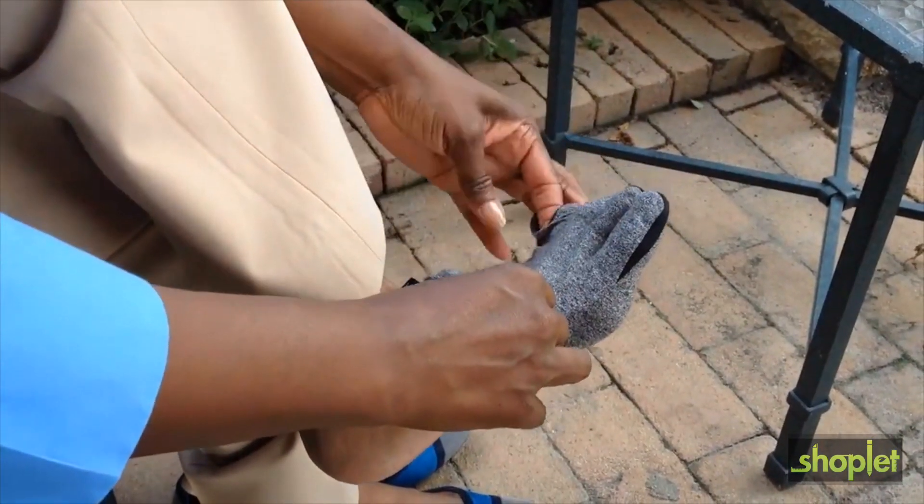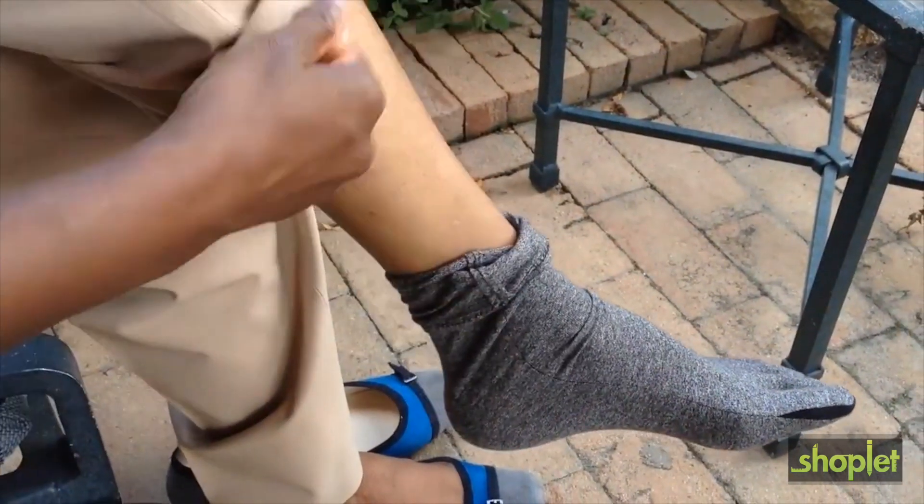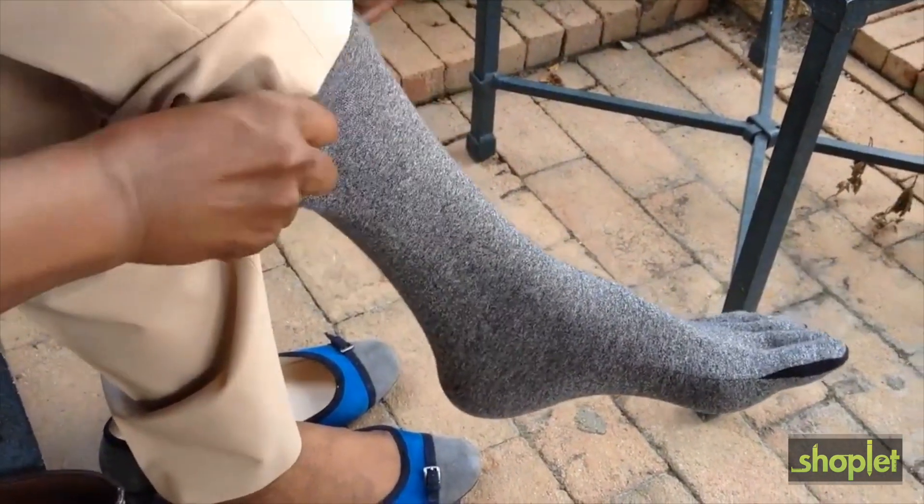Made of a soft breathable cotton material, there are three comfortable sizes to wear both day and night. Find your perfect fit by looking on the side of the box.